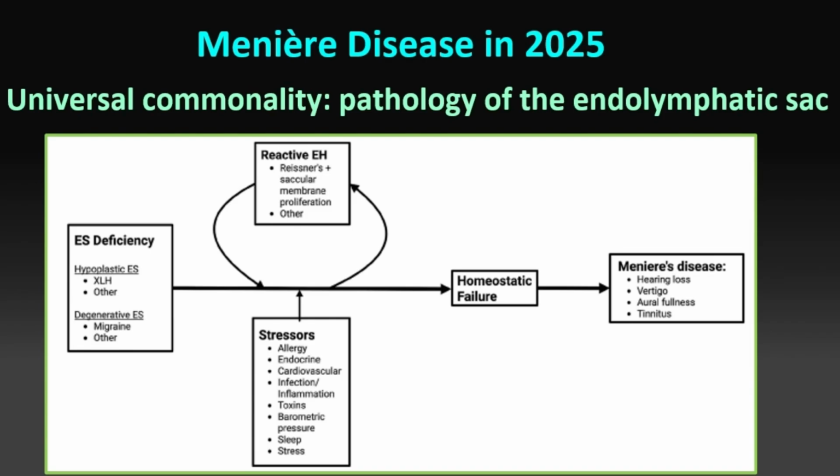So then if you do the correct sequences to image, you'll find enhancement in the perilymph space, but not endolymph. Now, for the first time, you can actually distinguish between these two fluid entities within the inner ear, as opposed to just how we usually see fluid all looks bright on a heavily T2-weighted sequence. So this is the first time.